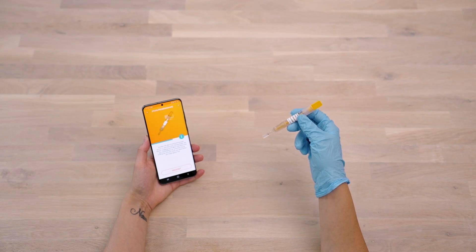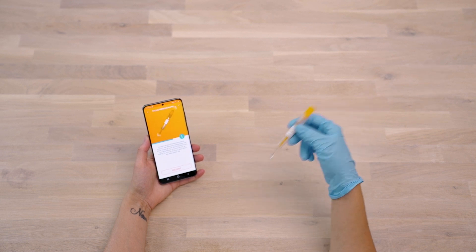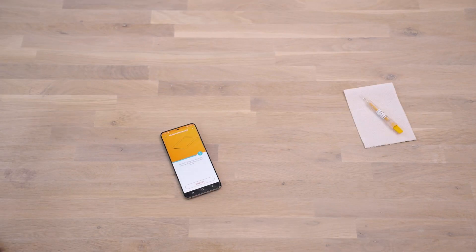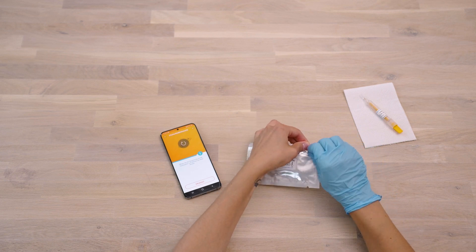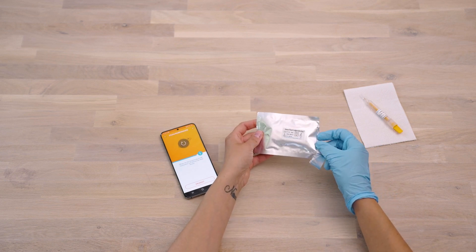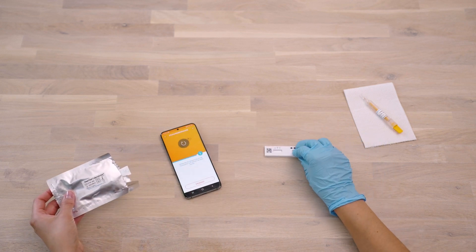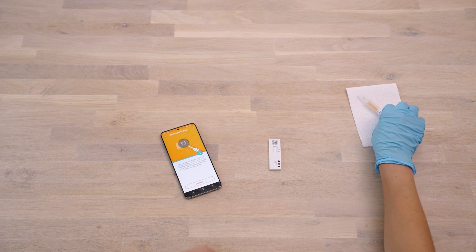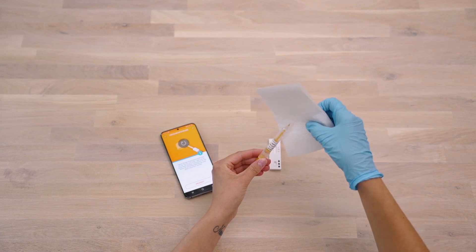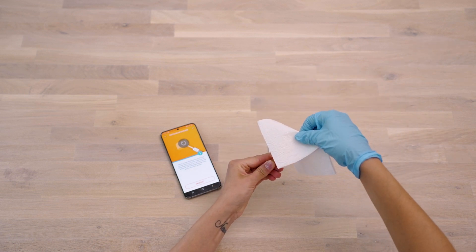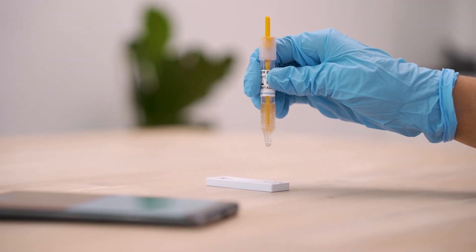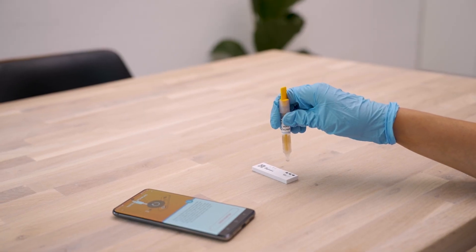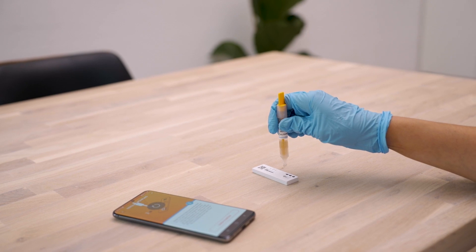Shake the sealed sample collection tube vigorously until the grooves from the sample collection stick are free of stool and everything has mixed. The buffer solution will change color only slightly. Remove the test cassette from the packaging and place it on a flat, dry, and light surface, making sure it is lying flat at all times. Now hold the sample collection tube with the tip pointing upwards, wrap a soft paper around it, and carefully break off the tip. Hold the sample collection tube approximately one centimeter above the sample application window of the test cassette.